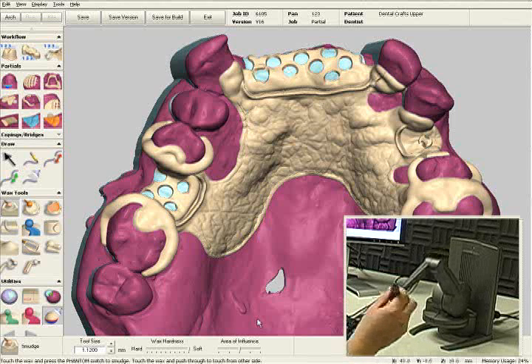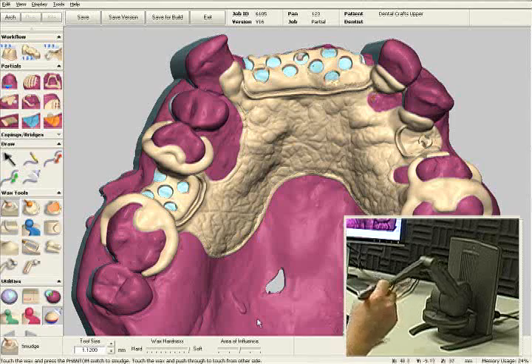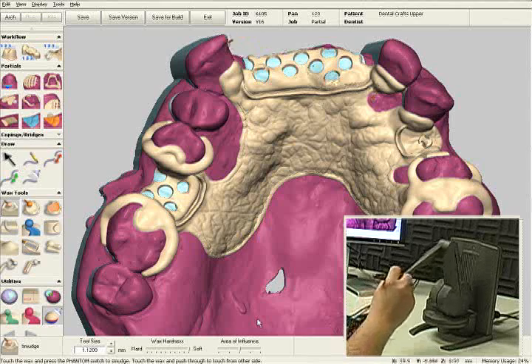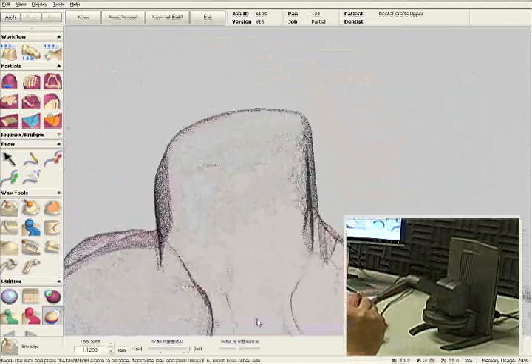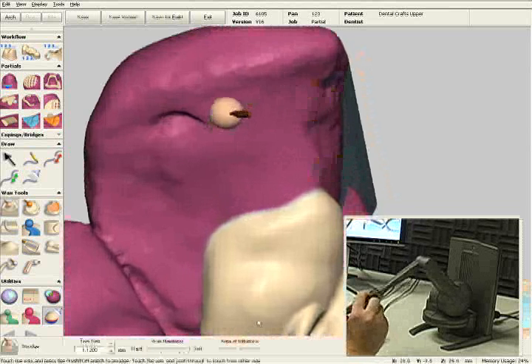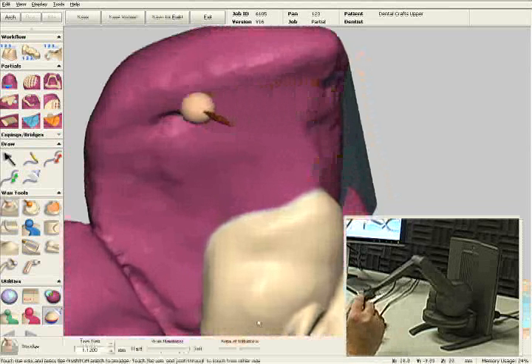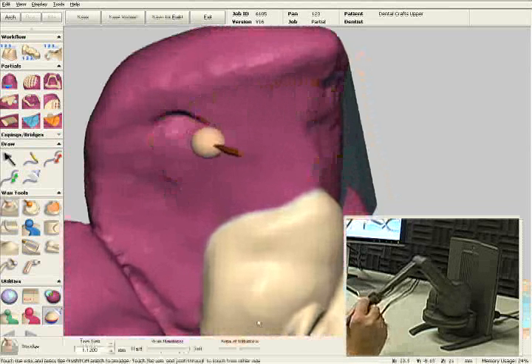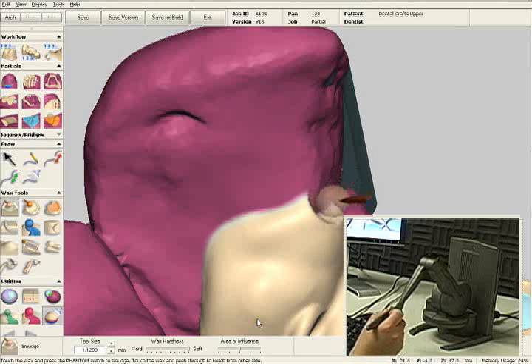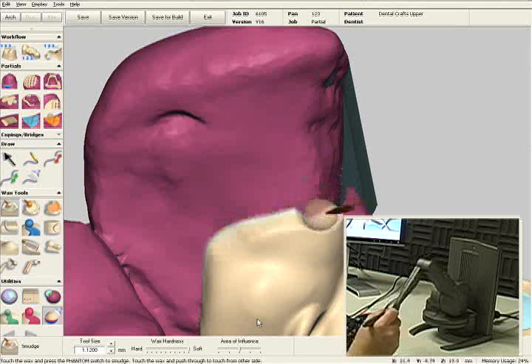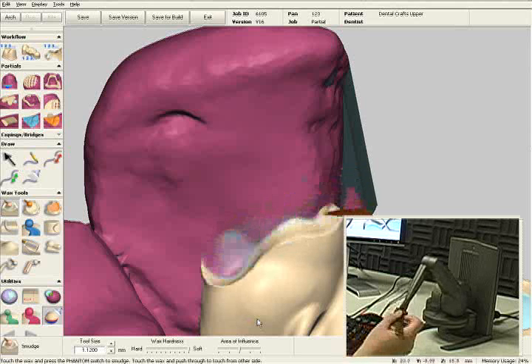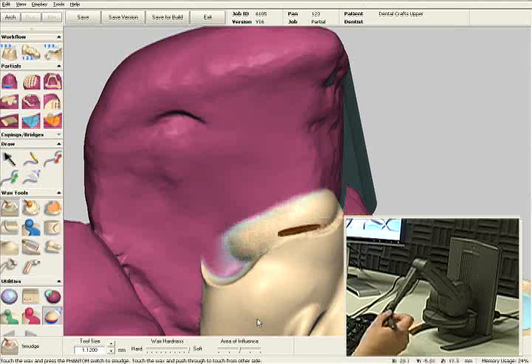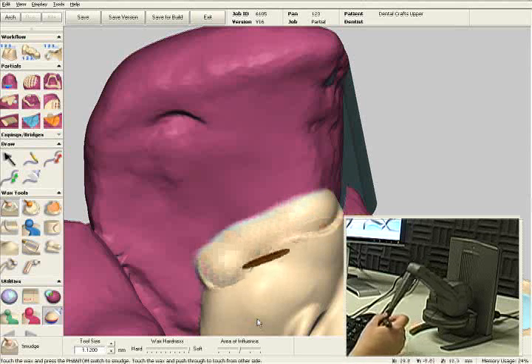The device I'm holding in my right hand, that's called the haptic device. The haptic device is very unique to our software. It actually allows me to feel whatever I see on the screen. I can actually feel this wax as I'm carving it away. I can also feel the resistance from the wax as I'm adding it back on.